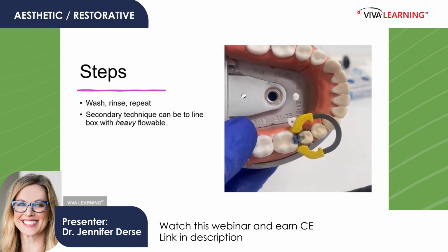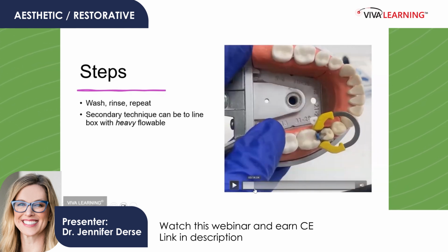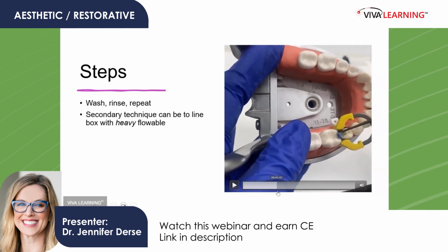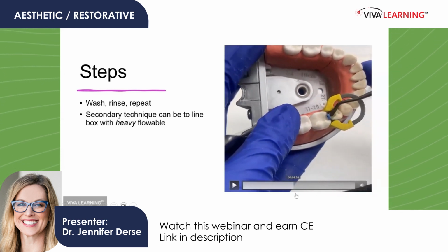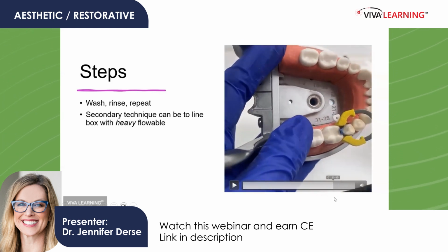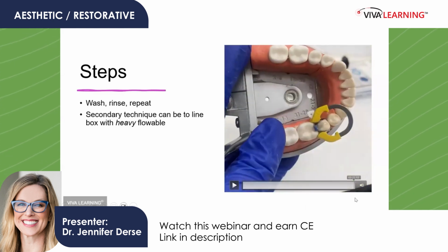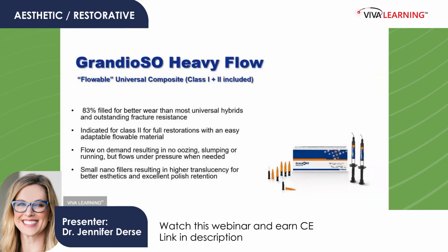And so then you can do that, and we'll just go through this video really fast. So that would be if you wanted to put the flow in there, and then you can fill it. And again, go ahead and shape it again. Clean off any excess. Light cure it. Add your second step to make it from a class 2 to class 1. And boom shakalaka, you're done. Okay? So again, I'm just going to reiterate using the heavy flow if you're going to use it in your boxes. Okay.